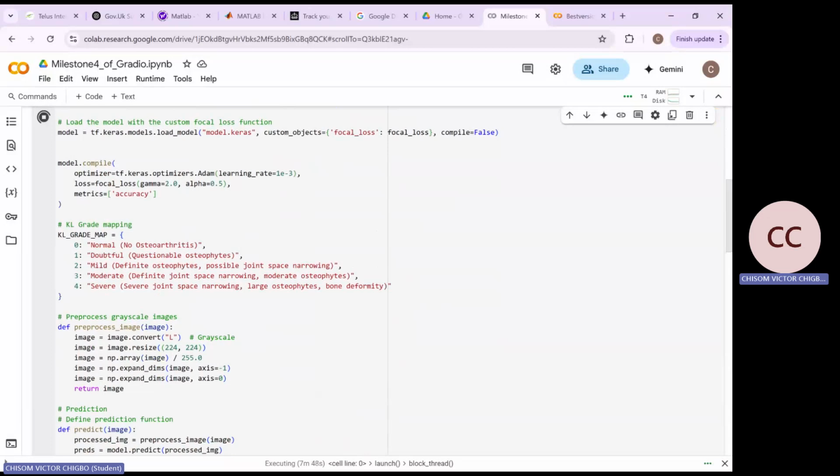Hence, trying to get diagnosis as quickly as possible by using an automated method like this, a perfect version of this will be deployed to just reduce the waiting times on expert interpretations, which are still done by humans who might be having a bad day. Not to say that the experts are not. They do their best, but humans have limitations. Robots, you just need power and the right settings and the environment they need. They don't have to go on shifts. They don't have to swap.